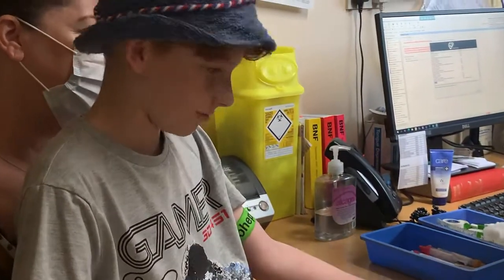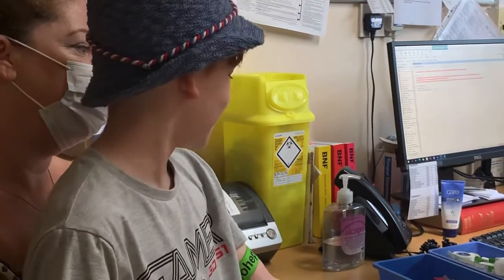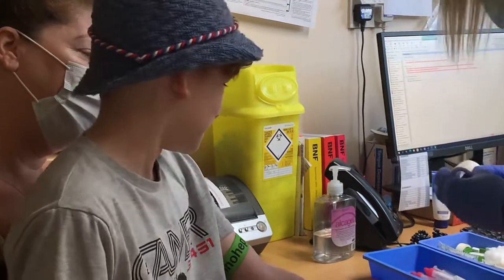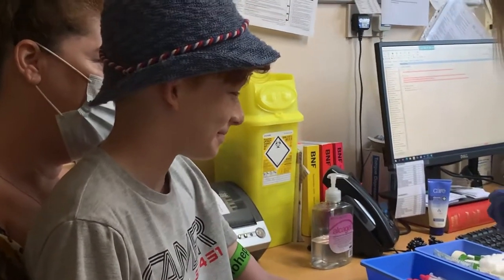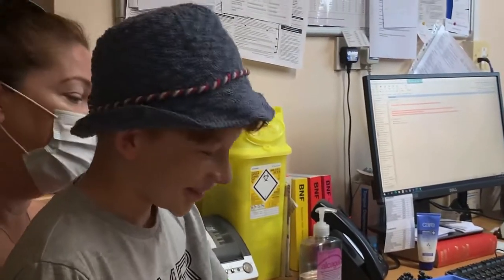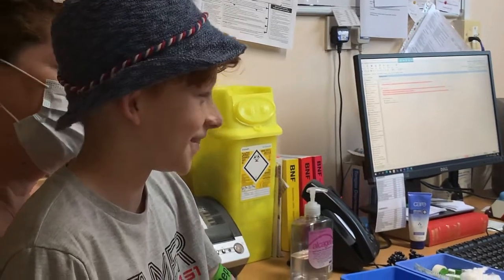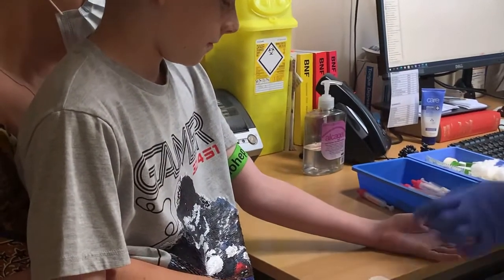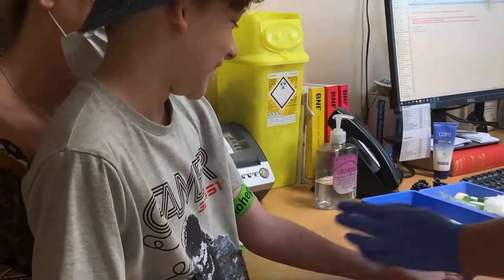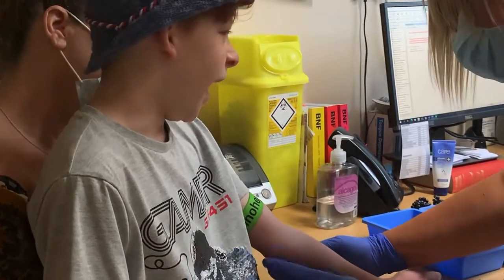Because she doesn't hurt — do you want to look at it? It's a tiny, tiny little needle. It doesn't hurt; you might have a little pinprick scratch. Okay, first goes in — okay, that's it. Once you see, we can just draw. I've got two bottles to get, so it's going to take about 20 seconds. I want you to keep your arm as straight as you can.